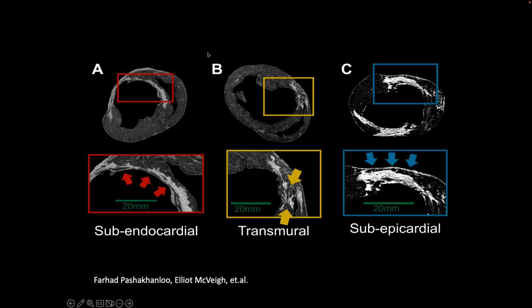So to make images that look like this in a beating human heart was a goal of ours about 20 years ago. We said, okay, I can let the patient be in there for 20 minutes, 30 minutes, an hour. Let's see what happens if we image them for an hour and just get more and more signal, such that we can make smaller and smaller voxels. I went through 2 PhD students and a postdoc and myself and 1 junior faculty. We did this for 2 years, probably.